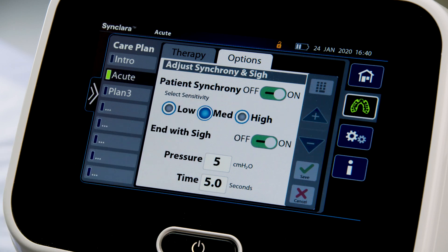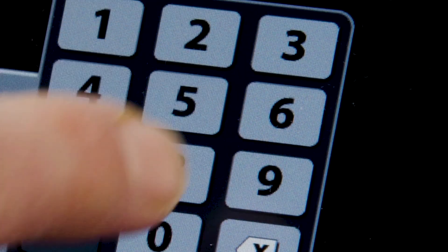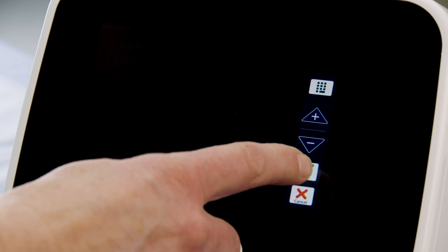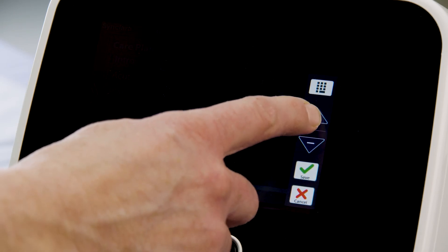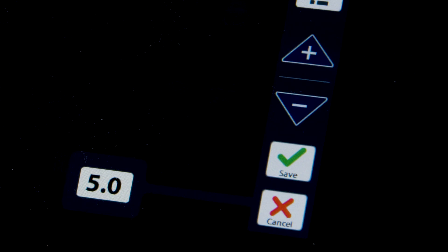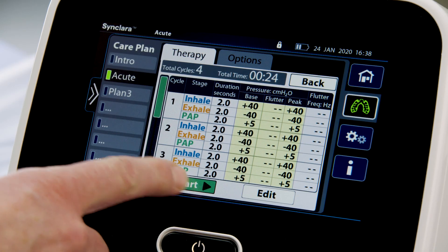To enable End with Sigh, slide the setting to On, then press the setting to change the pressure or time. Use the keypad control to enter the required setting, or use the plus or minus control to adjust the setting. Press Save to save the changes, or press Cancel. To start the therapy, press Start.